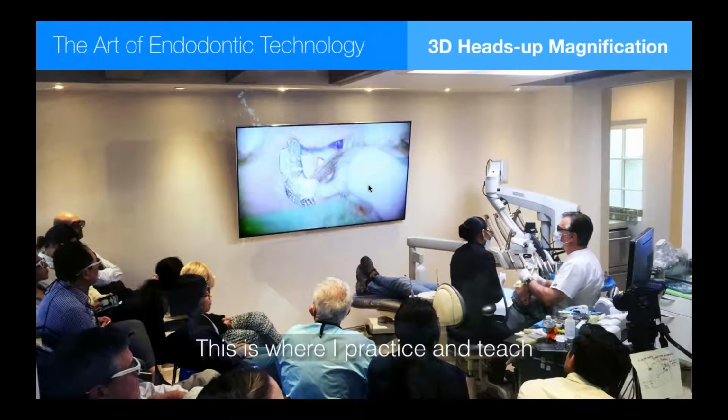And I have an Apple Watch that will not let me sit in the same position for more than 20 minutes without telling me to get up and move around. And having oculars on a microscope is the antithesis of that. And I have had 4 back surgeries. Even when I didn't have any impingement, at the end of the day, looking at a microscope, I felt like the 100-year-old endodontist. Now, when I sit back in my chair and I look up, it's natural.